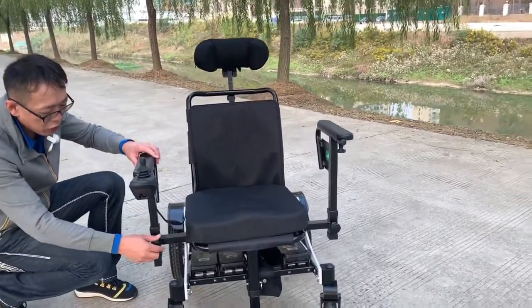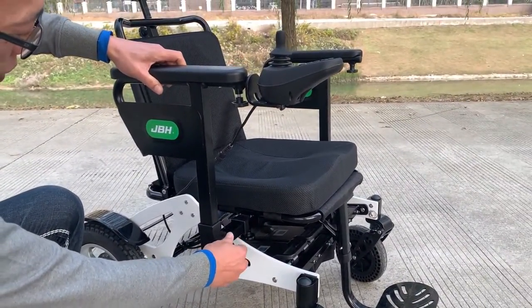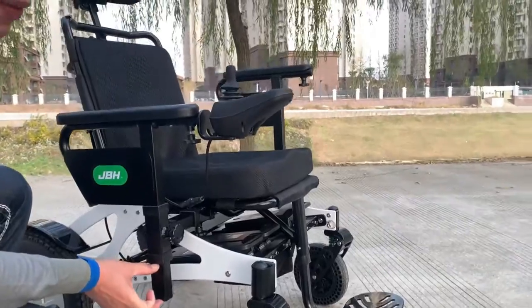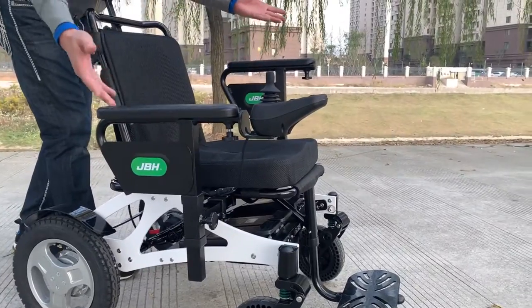Also, you can adjust the height of the armrest — from this height you can lower it down about 10cm of travel. On both sides you can do the same adjustment.